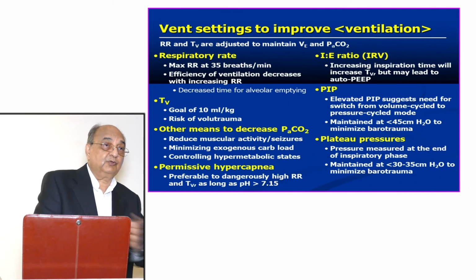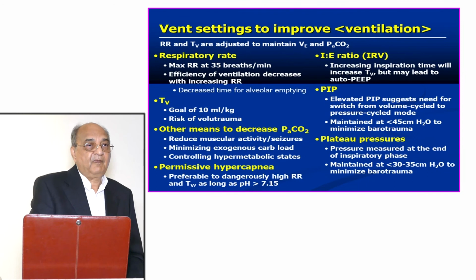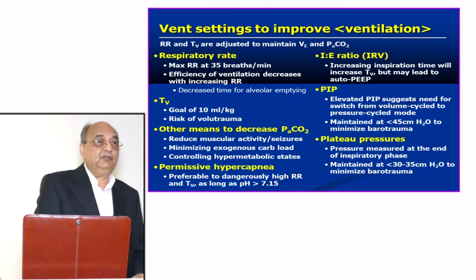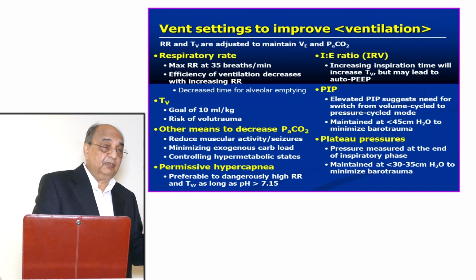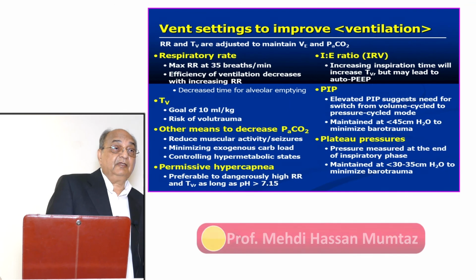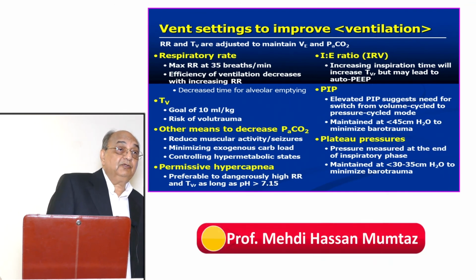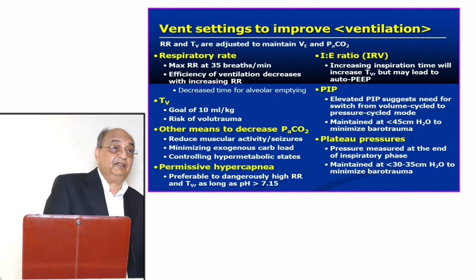If you wash out the CO2 from the alveoli, automatically carbon dioxide will come from the blood and it will cure the hypercarbia. On the other hand, if you look at the PaCO2, it has gone down very much. So depending on the condition of the patient, sometimes we intentionally lower the PaCO2, but sometimes reduction of PaCO2 is because of our bad management of the ventilator. So it could be you are giving an increased respiratory rate, or you are using a large tidal volume. You adjust that to have a desired level of PaCO2.